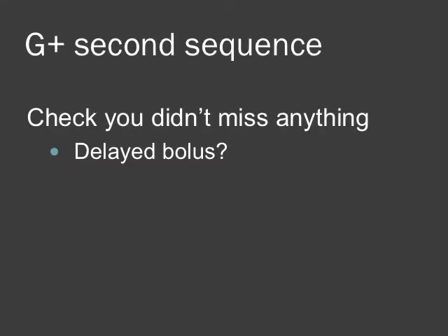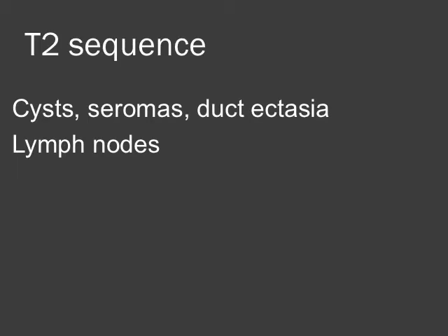Quickly run through the second gadolinium-enhanced sequence in a similar manner to see if there are any lesions appearing on that sequence. Sometimes there's a delayed bolus, so the first sequence may not be the peak of enhancement — it may actually be into the second sequence rather than the first. Then run through the T2 sequence separately, looking for cysts, seromas, duct ectasia, and lymph nodes, which are commonly bright on T2.